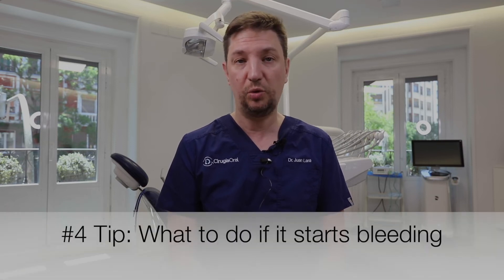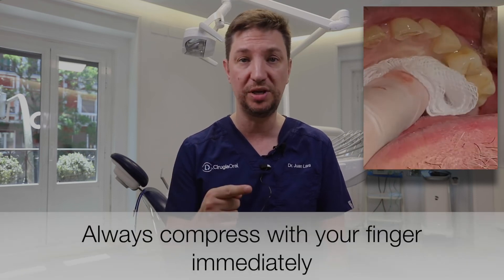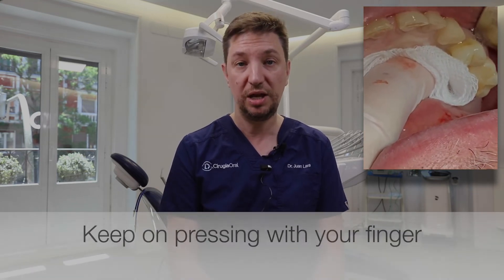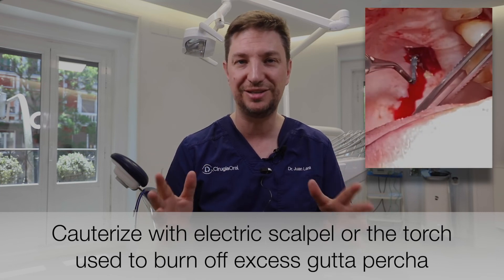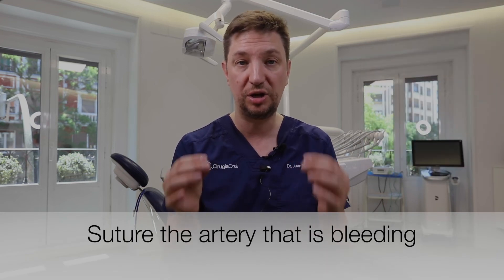The fourth tip talks about a complication: what if, when we are harvesting the free gingival graft, it starts bleeding? We have three options. First, compress with your finger immediately — just compress what is bleeding and the bleeding will stop, giving you time to think. Second, you can electrocauterize with an electrical scalpel — it will stop the bleeding, though it might smell a little strange. The third option is to suture right behind the artery to close it and stop the bleeding. So remember: if bleeding starts, compress immediately with your finger and then decide what to do next.